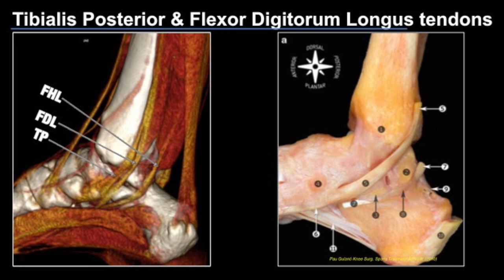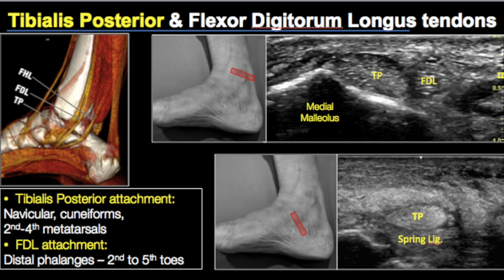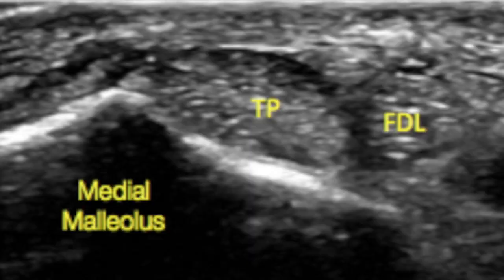The tibialis posterior on the short axis is seen as an echogenic structure with a brush border appearance — it looks like any other tendon in the body. Right adjacent to that is the flexor digitorum longus tendon. The tibialis posterior is almost twice the size of the FDL tendon. When scanning, we scan all the way from the supramalleolar segment, the retromalleolar, and the inframalleolar segment as the tendon attaches over the navicular.